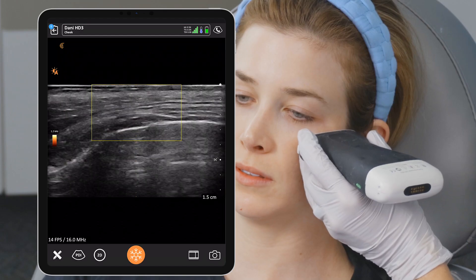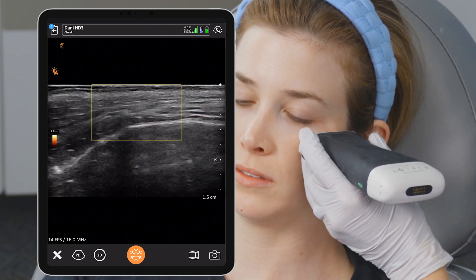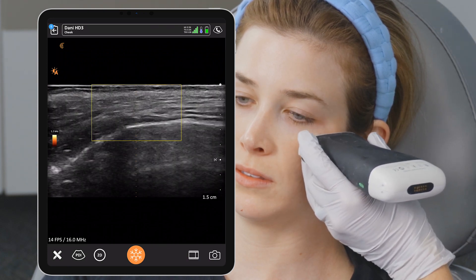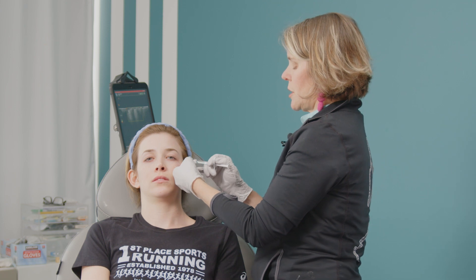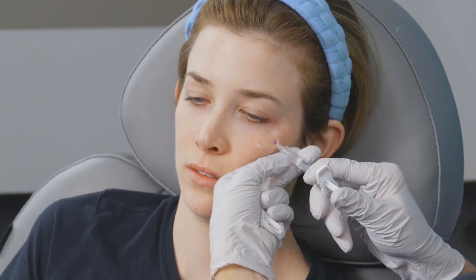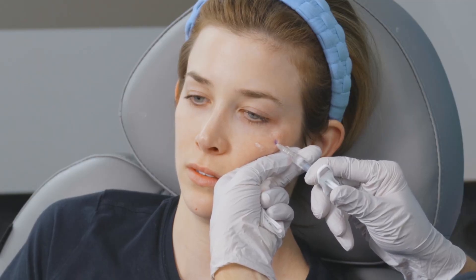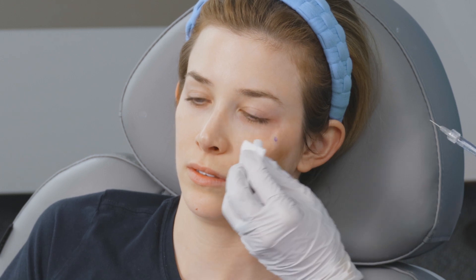So I have just safe mapped that spot. I'm very happy with it. That is a successful safe map — looking at the zygoma, the arc of the zygoma, down to bone. That hyperechoic white line. It looks good. So I feel good about laying a bolus there. I take my Hibiclens and dab it one more time just to be sure, then go that same exact path going down to bone. We put a little 0.2 bolus right there. And that is it. You can always just massage it down.